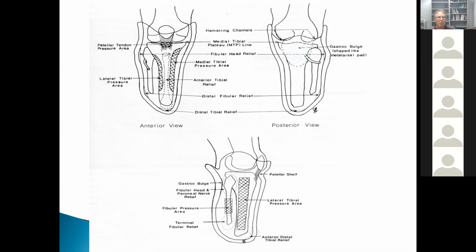So instead, what they have to control the external knee flexion moment is just the tibia against the anterior wall of the socket. And what is most distal, so where is there the highest pressure, is down here, this anterior distal end of the tibia. Also the end of the fibula, then the fibular head are all especially, excuse me, pressure intolerant areas.